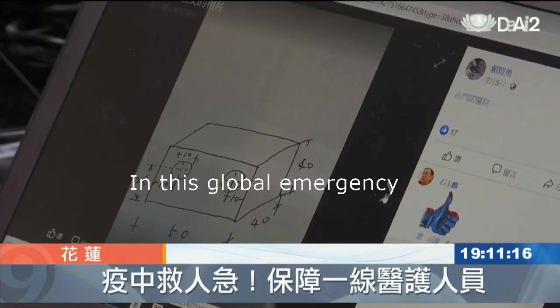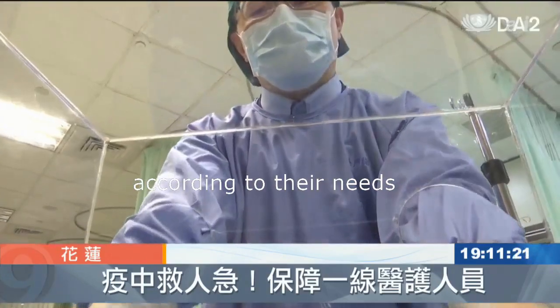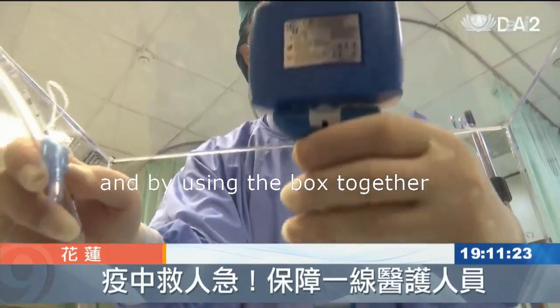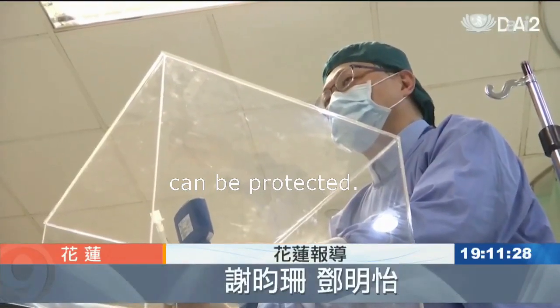In this global emergency, by providing the design drawings to let everyone modify the design according to their needs, and by using the box together with a video laryngoscope, front-line medical staff can be protected.